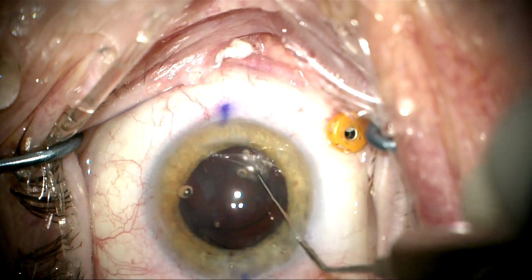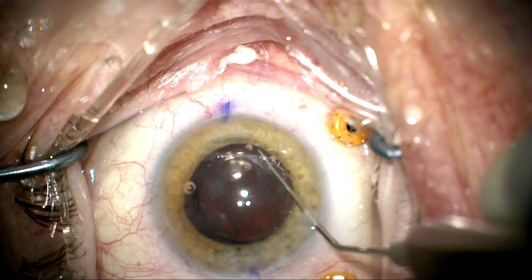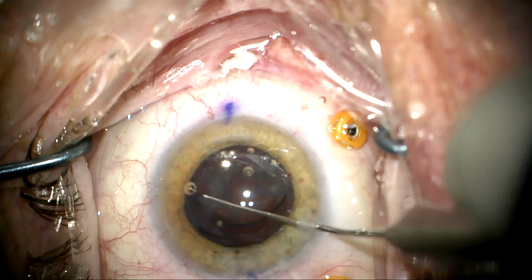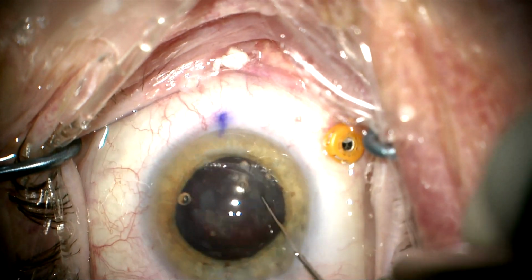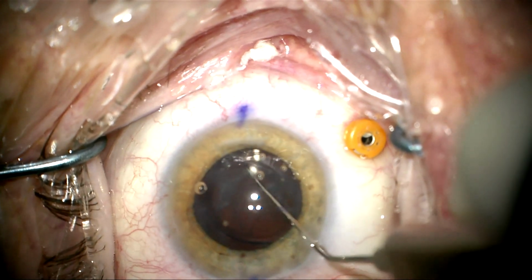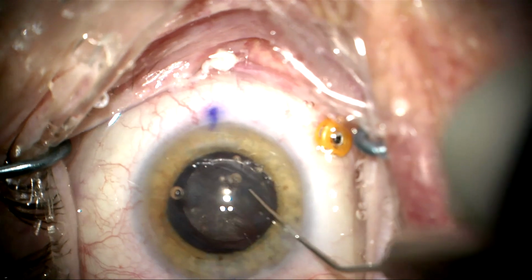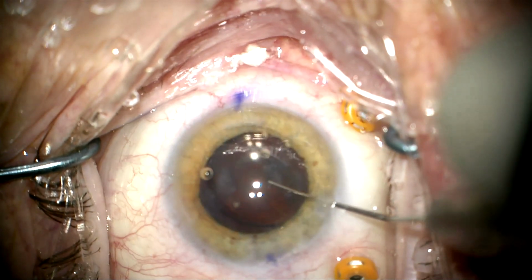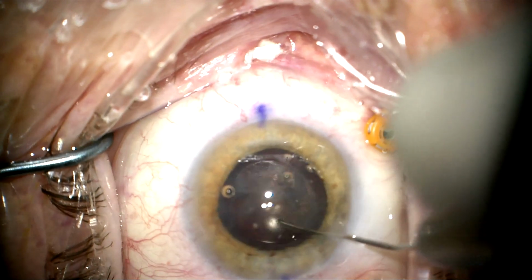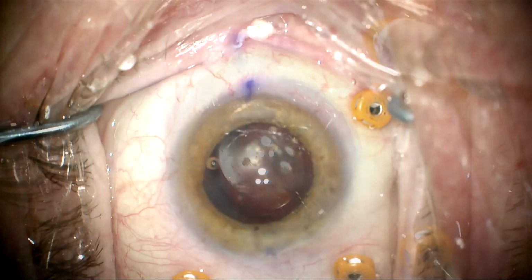We're now going to dial the lens into the proper position, rotating it with a Sinskey hook. I'm being careful not to push too hard as I do this, just to sort of gently rotate this. And I'll leave it just shy of where we want the lens to actually end up. As I do this, it's kicking up a lot of Soemmering's ring material, which we're going to deal with in just a moment.